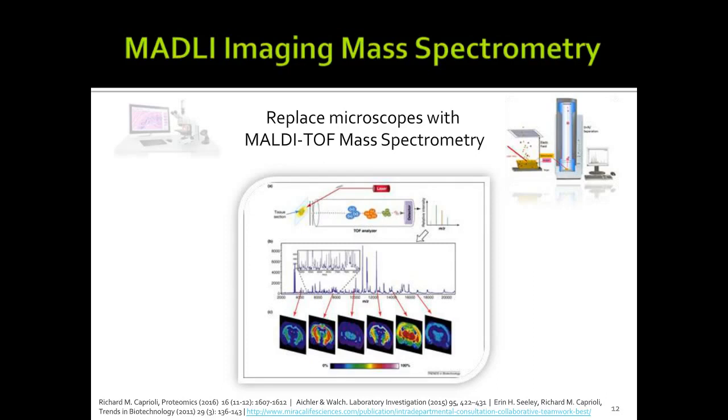We know MALDI typically produces singly charged ions, and it has a bigger molecular weight range, going up to here at 20,000. Each spot can come with a spectrum like this, so one tissue slide can come with hundreds of thousands of them. Then this can be mapped out for each compound, by molecular weight, across the 3D dimension to see where they are located on the tissue.